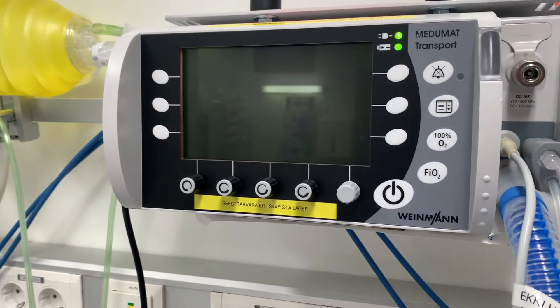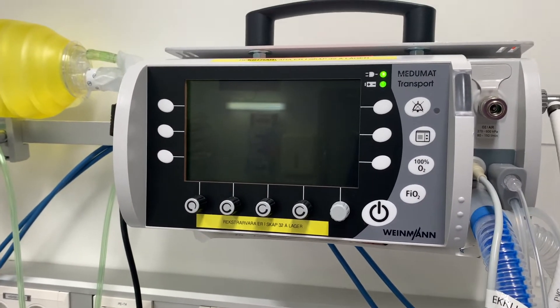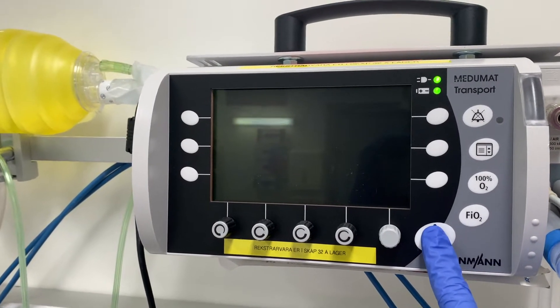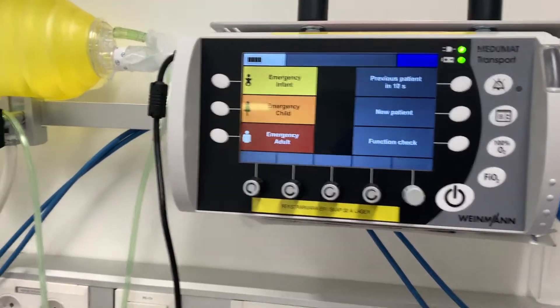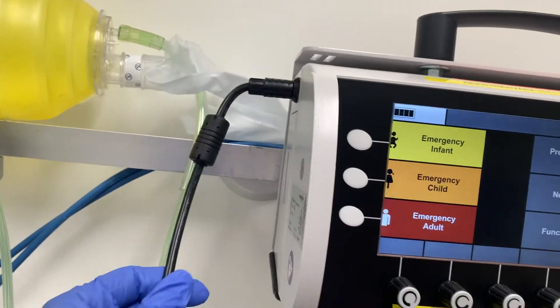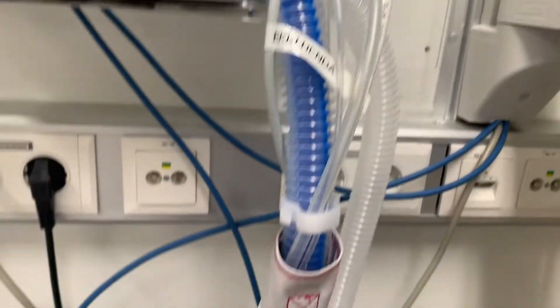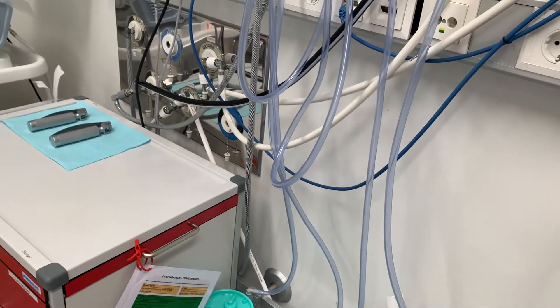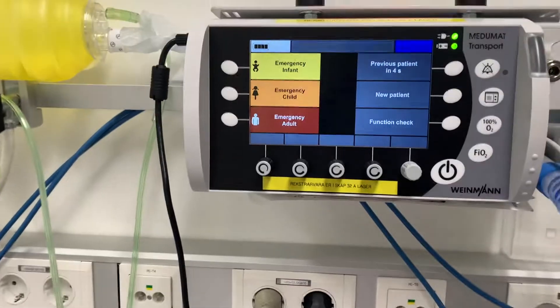Hi, this is Eric. I'll show you a movie on how to set up the ventilator. The first step is to start it by pressing the power button. Make sure it's connected to electricity and also that the oxygen source is connected all the way down to the wall.